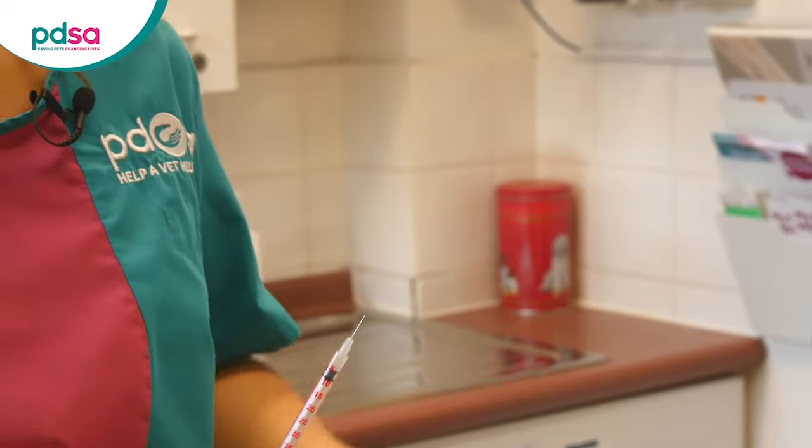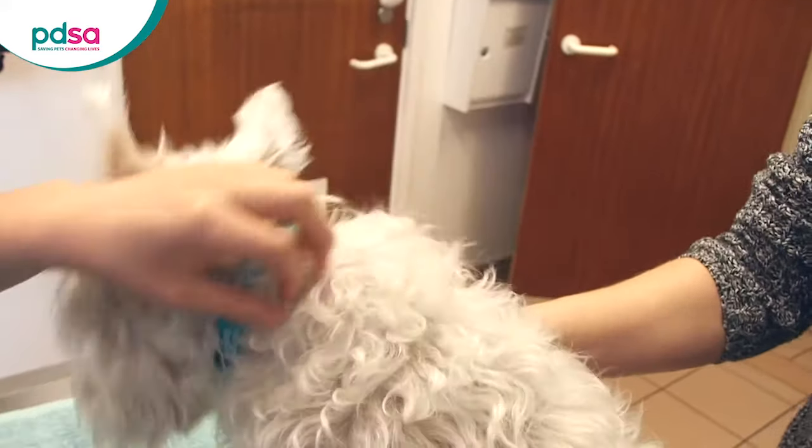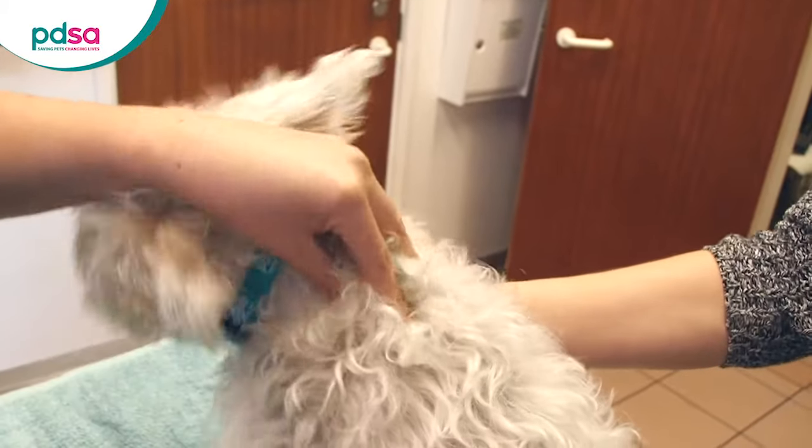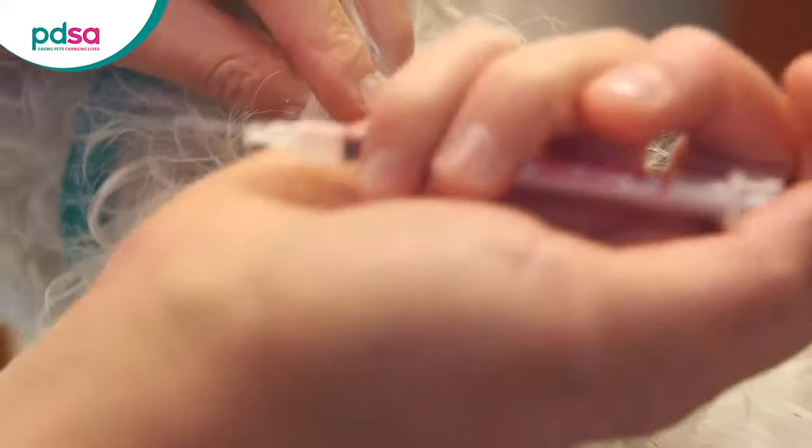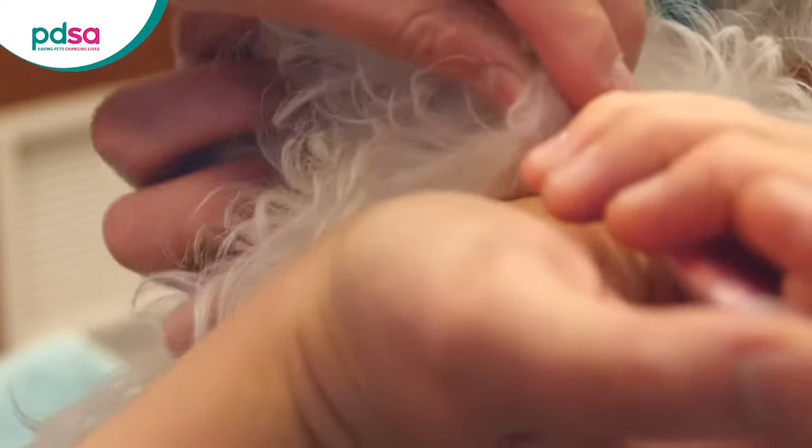Carefully withdraw the syringe from the bottle. If you have someone to help, get them to very gently hold your dog or even just put a hand on them and stroke them. Gently gather the scruff at the back of your dog's neck. Your vet may have clipped an area to show you where it's best to inject. Put the needle in so that the insulin can be injected under the skin.